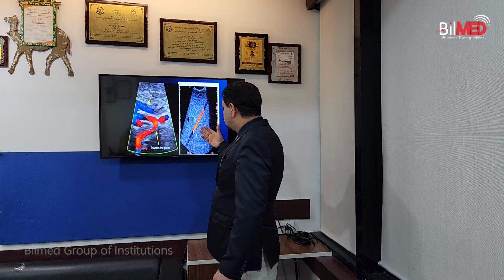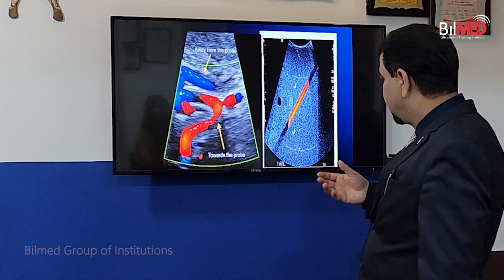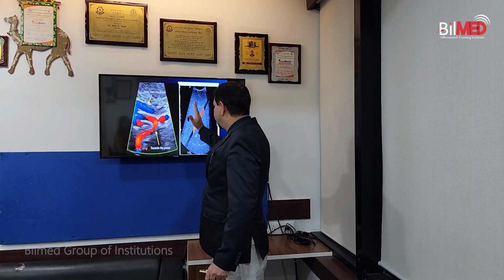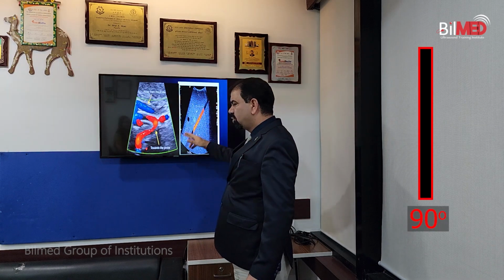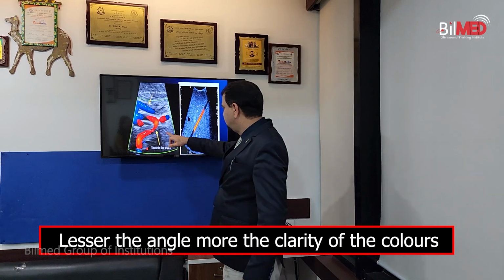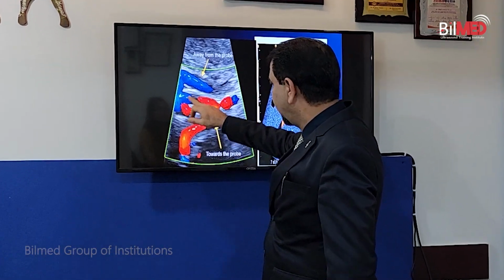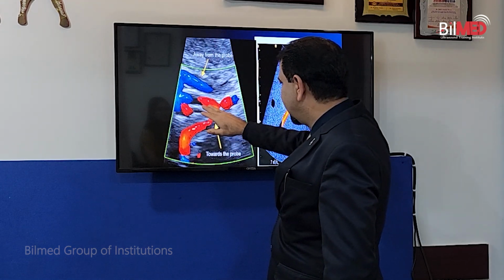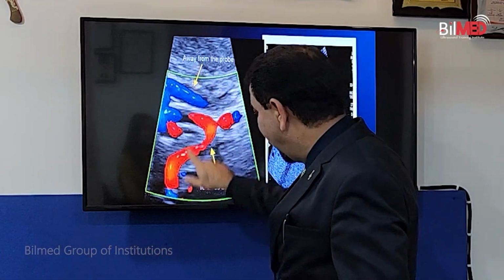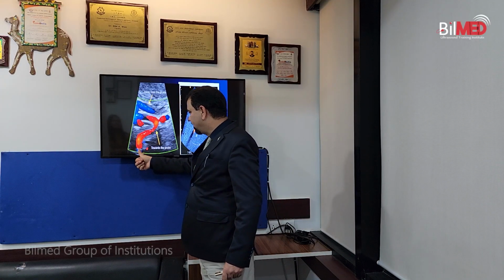Practically, the angle of insonation means that the vein, artery, or whatever vessel you are scanning should not be hit by 90 degrees, but should be hit with a lesser angle. The lesser the angle, the more the clarity of the color. Now see over here, this vessel is getting hit by 90 degrees. That is why the color is missing over here, and this vessel has a lesser angle. That is why I am having good flow here, and very little flow there. So this is the importance of the insonation angle.